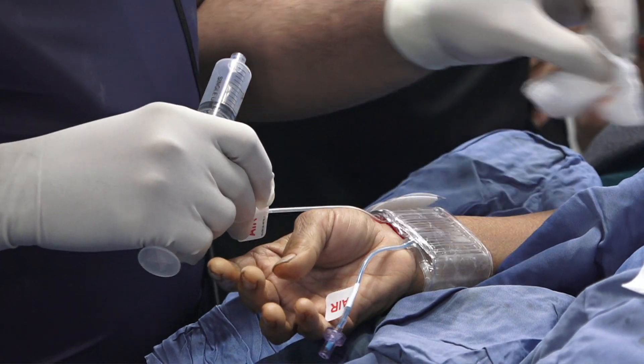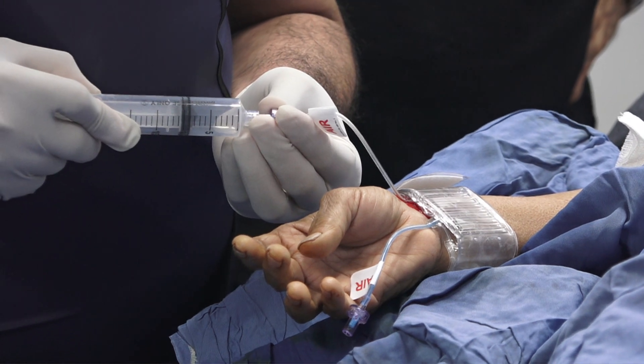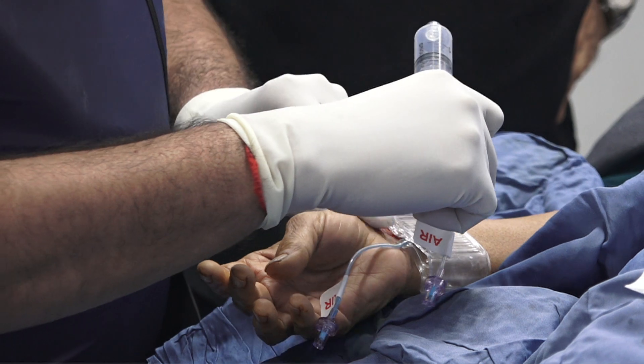Watch it. Now if you start seeing some bleeding, you can always add a little more air. I added about half a cc to one cc, and you optimize it.